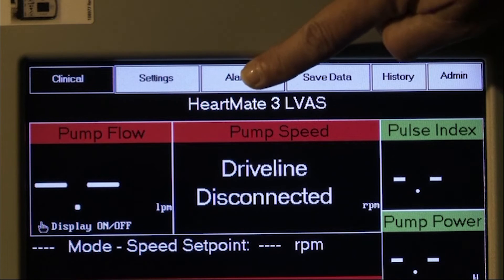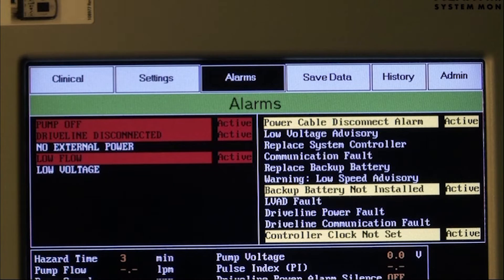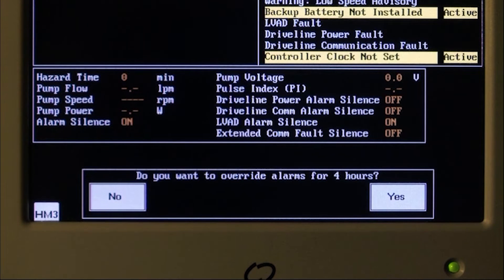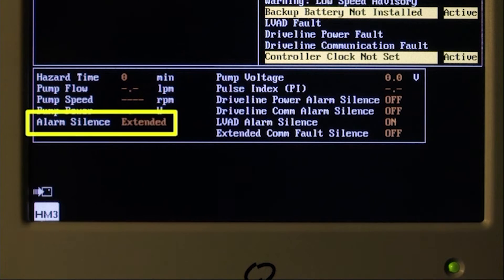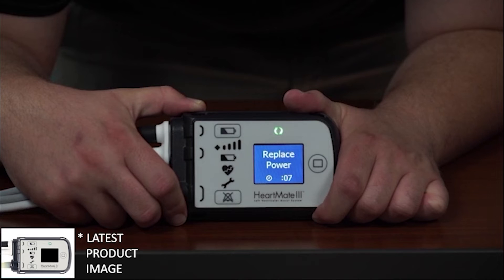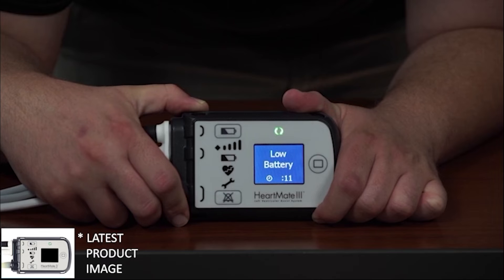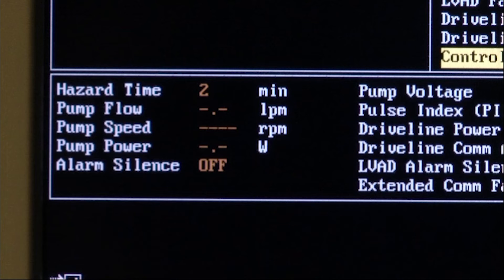Press the alarms tab to activate the alarm screen. Then press the extended silence button in the lower right corner to ensure that all hazard and advisory audible alarms will be silenced for four hours in the OR. The alarm silence will indicate extended. This can later be cancelled by pressing the silence alarm button on the system controller, verified by the alarm silence indicating off.